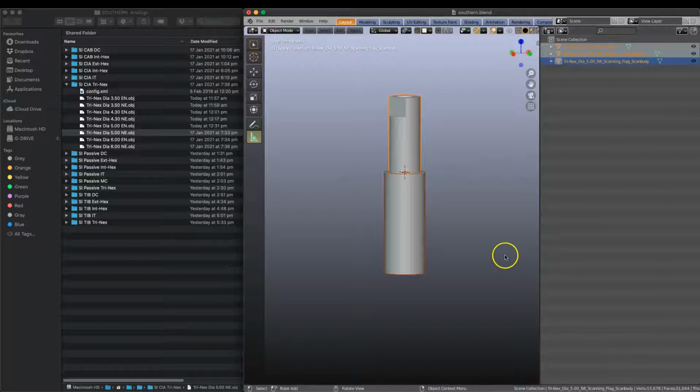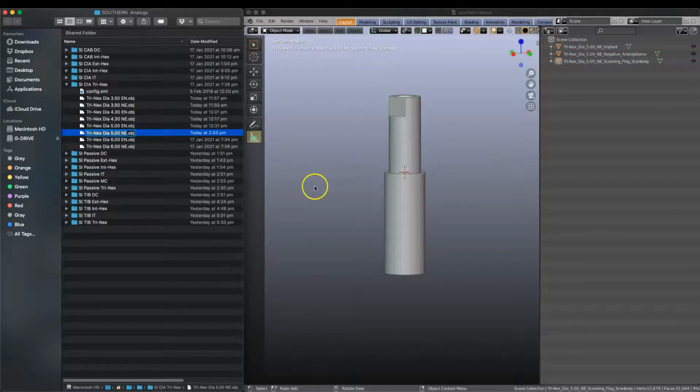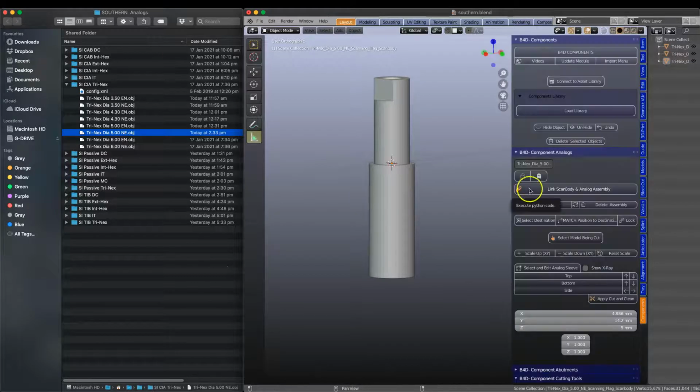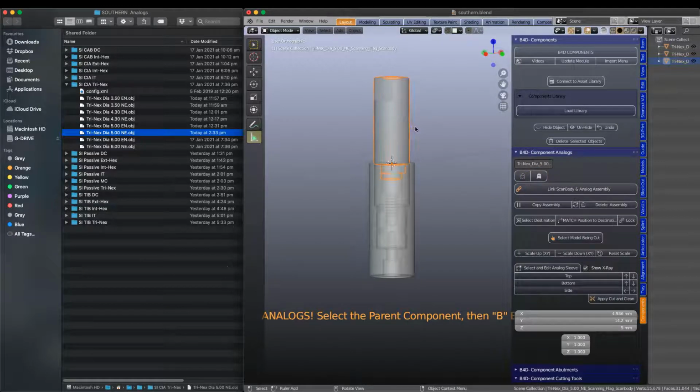Okay, wait for that, and then it's going to update here in the Finder window. Just wait for it. Here we go. Okay, to test the device to see if it works, we're going to go into the component module. In the component module, go into the analog section. We're going to select the ScanBody. We're going to go into transparent mode, actually select it now.